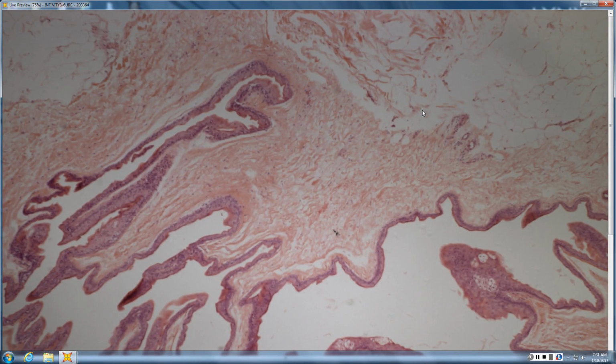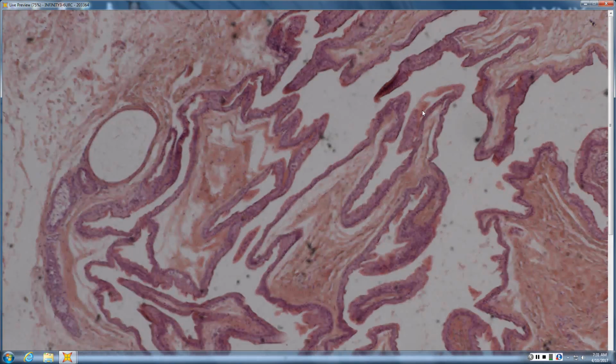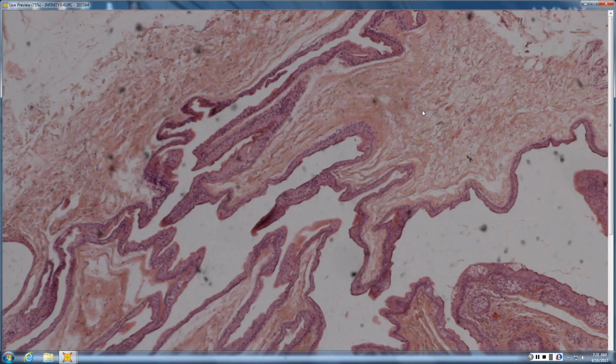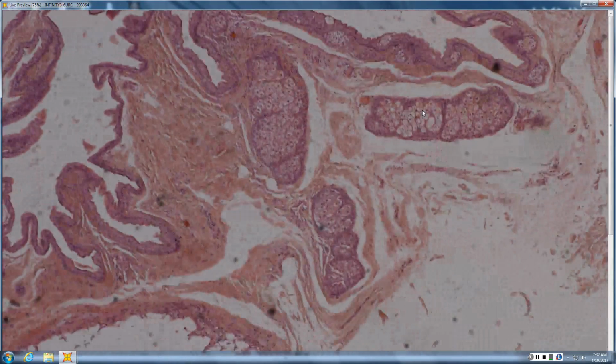Okay. Shane, you want to lead off? Sure. So looks like a sharp tooth lining cyst. Shark tooth lining, so give me two cysts that can do that. Dermoid cyst and steatocystoma. And which one do you think this is? I mean, there's some sebaceous glands, but no actual full terminal hair follicle. Yeah, so the only adnexal structure you see is sebaceous glands, so that's good for steatocystoma.